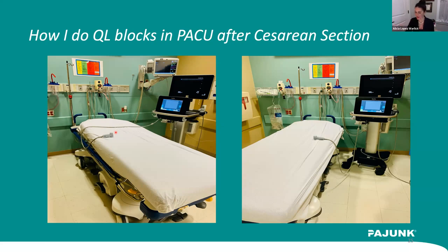So there's a bunch of chaos here. Usually there's a baby, and then there's pediatricians all over, and you just, like a ninja, come in and start your blocks while the spinal's still in place, and it's amazing. So that's how I do it. And after I place the right side, I just hop on over here and I push this ultrasound back against the wall. I don't move it around. It's too much time, too much effort. I want to do things fast and safe. So I just push this against the wall, and I come in here on the left side and I block the QL1 location here.